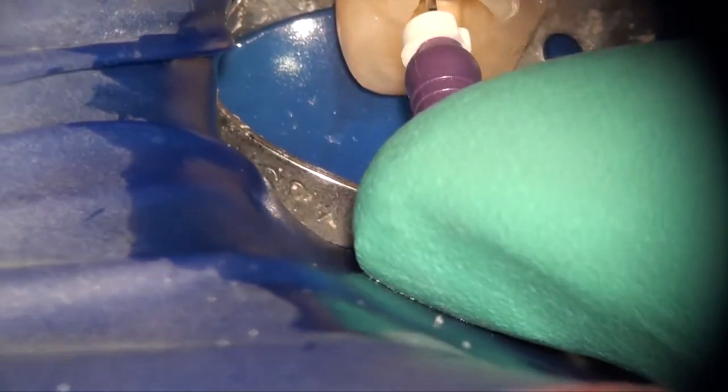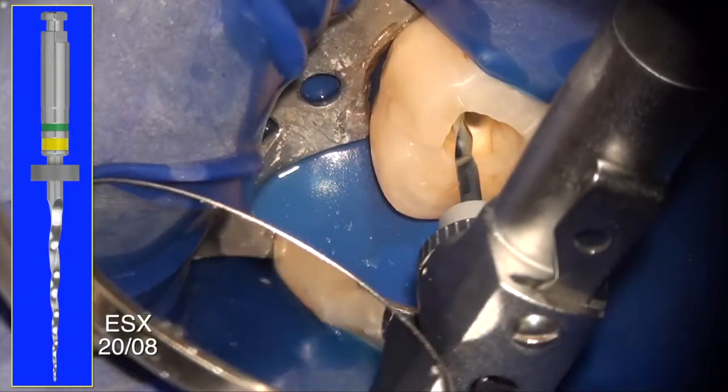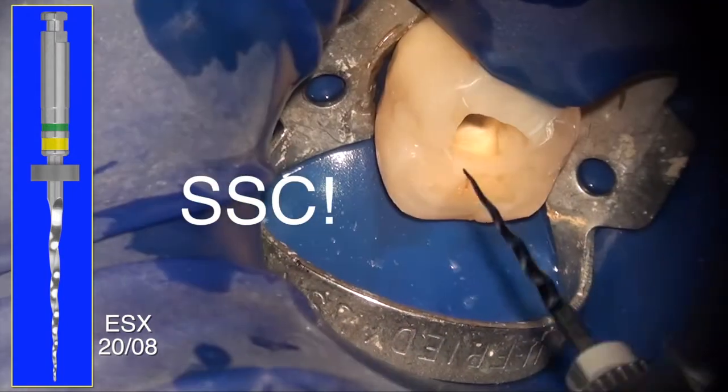Now the next thing to do is you take one of these number 10 stiff files and you just go, what is the available length, which is, I just push it in to where it goes and make a note of that length. I'm not trying to get down to the apex. Here it went to 14 millimeters on the mesials.